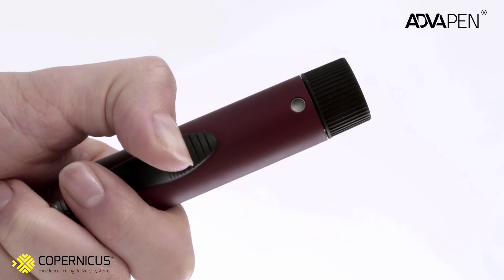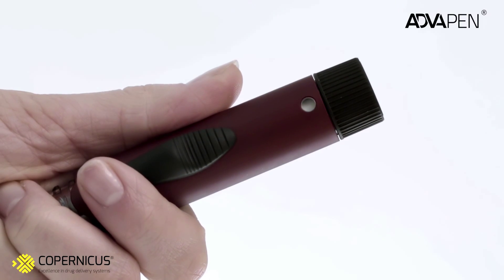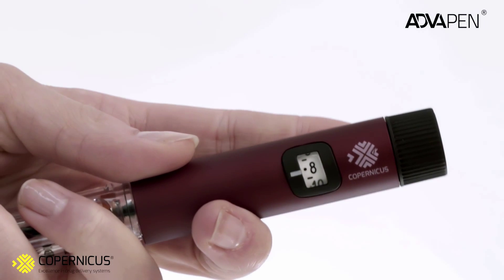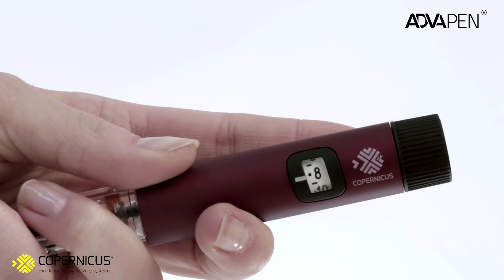If the green dot did not appear, it means the insulin in the cartridge is used up. Remember the number of units shown in the selector window — it corresponds to the number of units of insulin you must still administer to complete the injection.